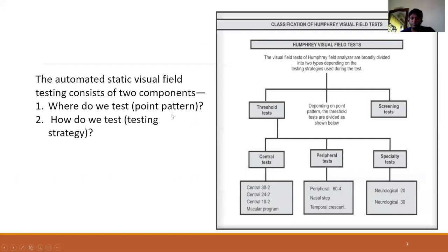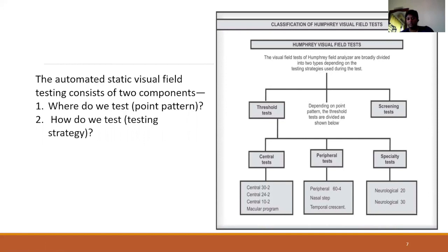Before we go into reading static perimetry or HFA visual field reports, we need to know two things: the point patterns and the testing strategies. A point pattern is how the particular points are distributed over the visual fields. A strategy is the time-intensity as well as the bracketing technique used to identify the thresholds. Visual field tests are divided into threshold tests and screening or suprathreshold tests.